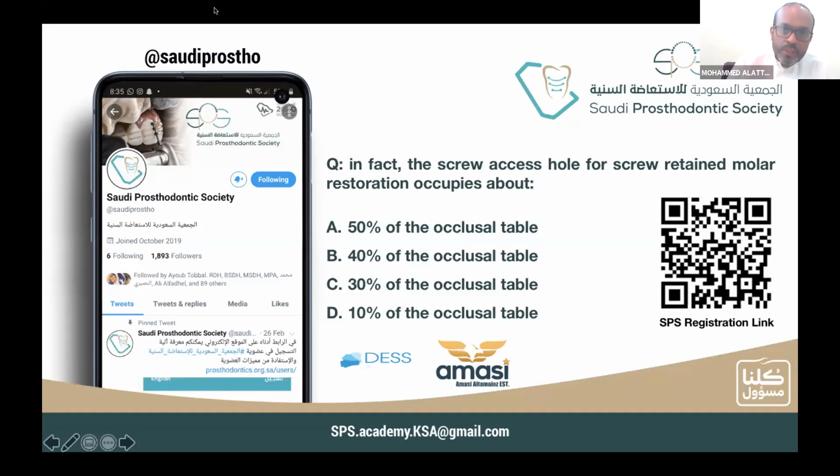What are the indications for the Duralay splint? This splint we use for the patient as a verification. What they recommend in this paper is that if any crack happens, it means your impression was not good or not accurate. It also happened with our case. When we placed this verification jig, there was some cracking for that patient. For that reason, we did the joining again with Duralay and took our impressions.